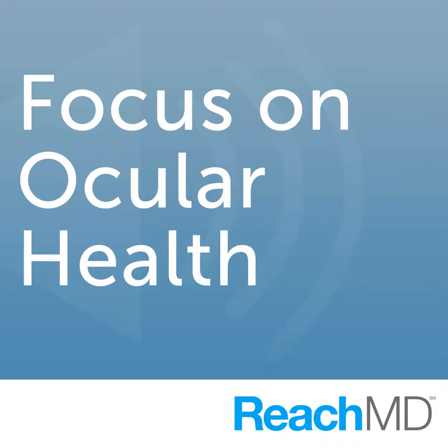Currently, what we rely on is individual cross-sections, which probably represent about 10 to 20 microns in thickness. So when we see one of these cross-sections, we're looking at a very small slice of the retina. What we would like to be able to do is actually reconstruct a whole block of retina that we can cut through and look at more subtle forms of pathology. And that's currently in laboratories around the world.